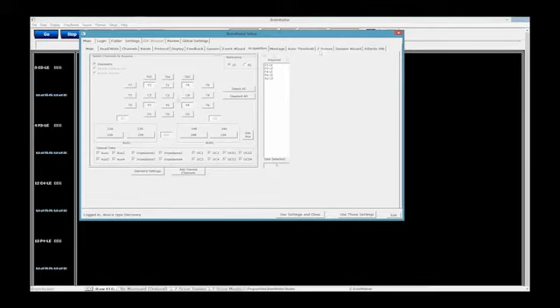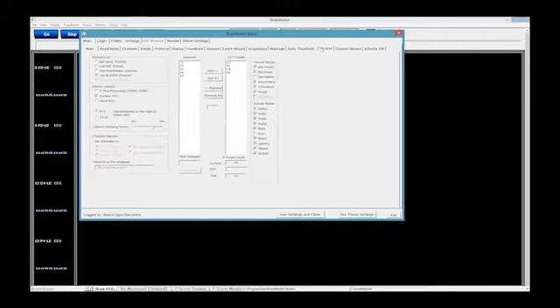After you change a site on this one, you would then go to the Z-scores tab. As you can see right now, it's saying it wants to train C3 and C4 in the LZT train because that's what we were last doing. So it's not remembering that we just switched these. We have to tell it what it's doing. So I'm going to hit remove all, and I'm going to hit add all. Now we are training the proper sites that we want for our LZT training. So that's one of the things you would do.